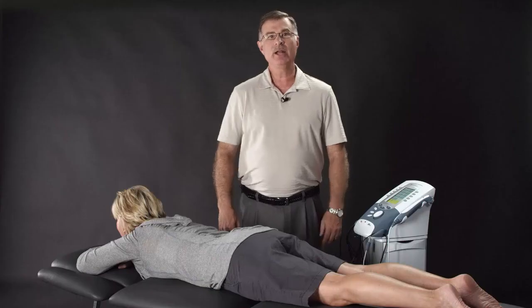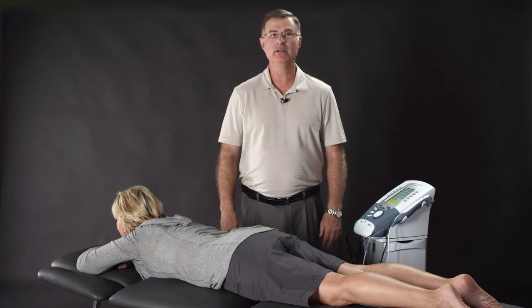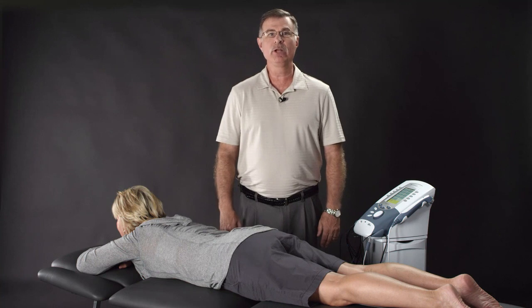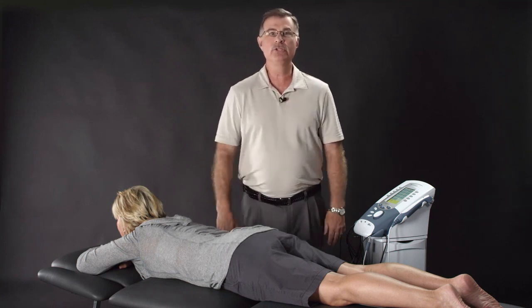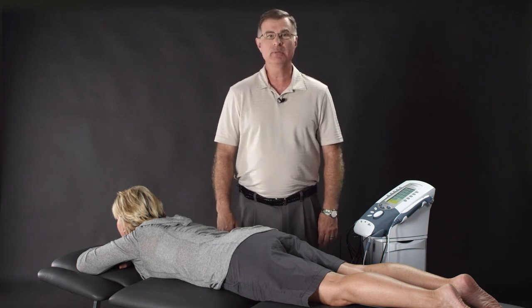Today I'm going to show you how to use interferential and premodulated to treat acute and chronic pain. Interferential current is a two-channel middle frequency unit, and when we cross the two currents, we get an interferential or an interference wave at the point or at the treatment site.